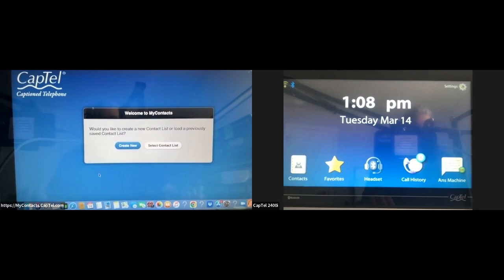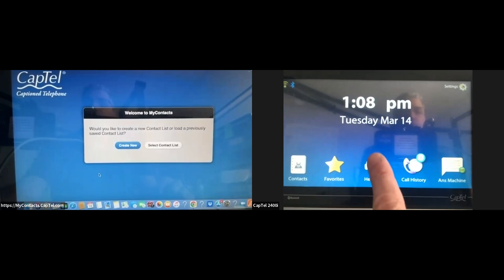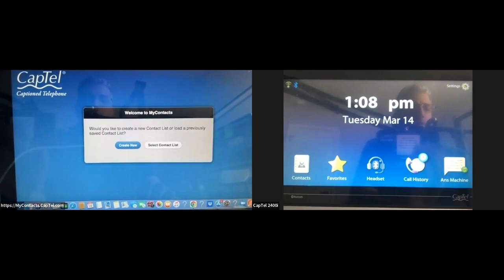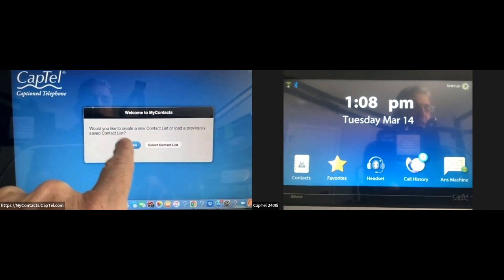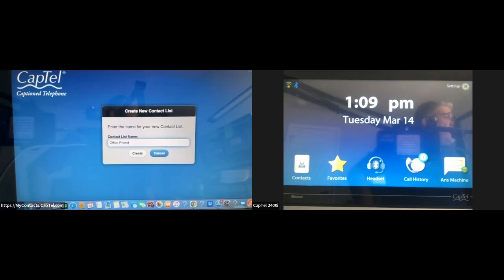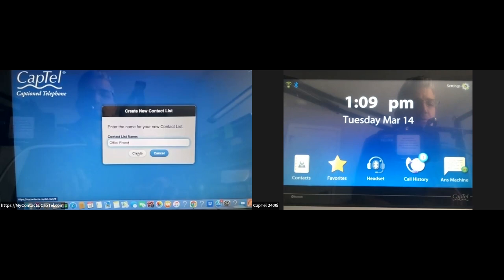Here on my computer, when I go to the website mycontacts.captel.com, it opens up the page. It asks: would you like to create a new contact list or load a previously saved contact list? I'm going to create a new contact list and give it a label — I'll call it 'office phone,' because I may have another CapTel phone downstairs for personal use and this one is for my business use. Once I'm satisfied with the label, that will take me directly to the page.